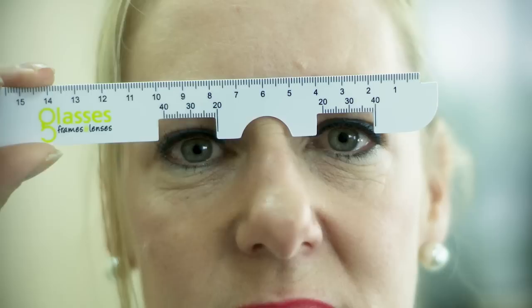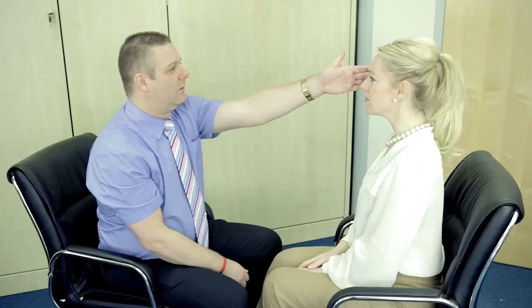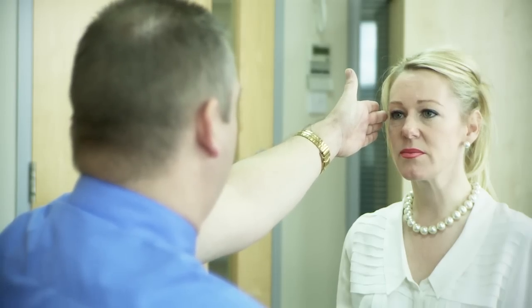The glasses frames and lenses PD ruler is designed to fit over the bridge of your nose with sections cut out for you to look through. With the help of another person, sit opposite each other about an arm's distance apart.